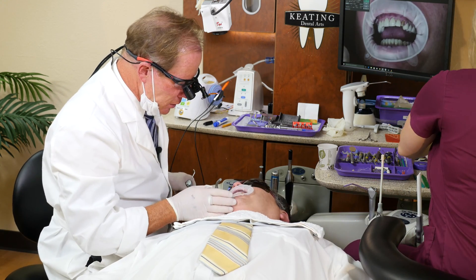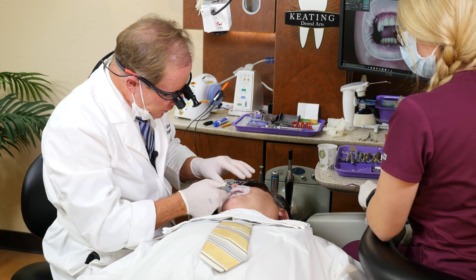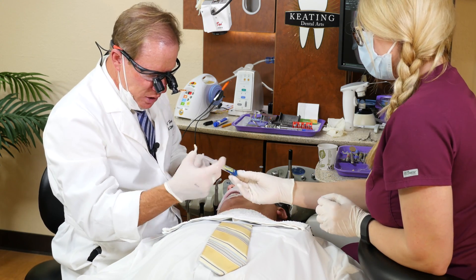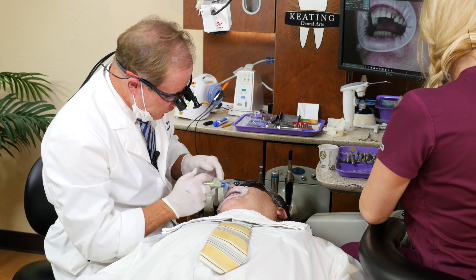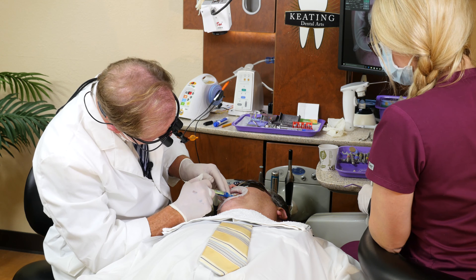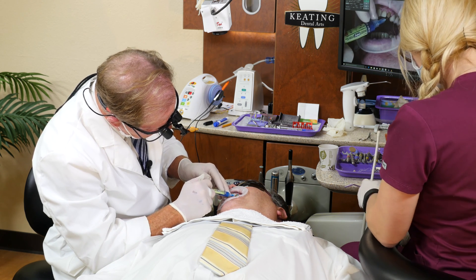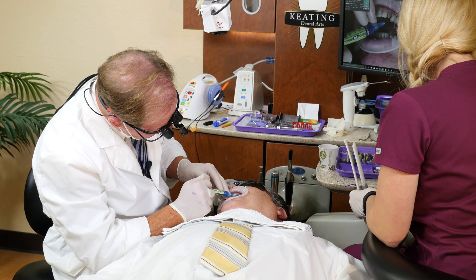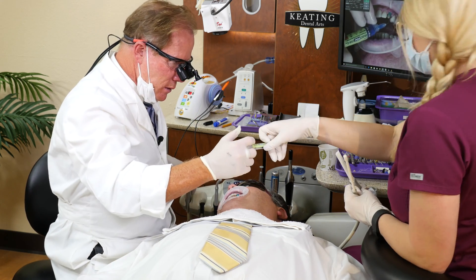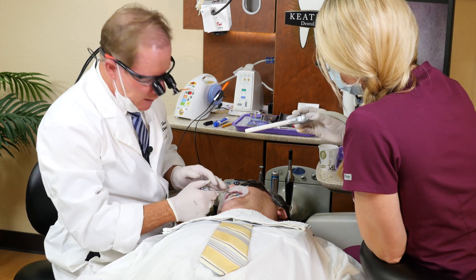Now we'll go to the tooth. We're going to utilize a total etch technique as we bond this into place. We're going to use 35% phosphoric acid followed by a dentin bonding agent. The dentin bonding agent will be All Bond 3 from Bisco. We'll go ahead and hit the enamel first, followed by the dentin — there's an enamel collar around this. Let it sit for at least 15 seconds.